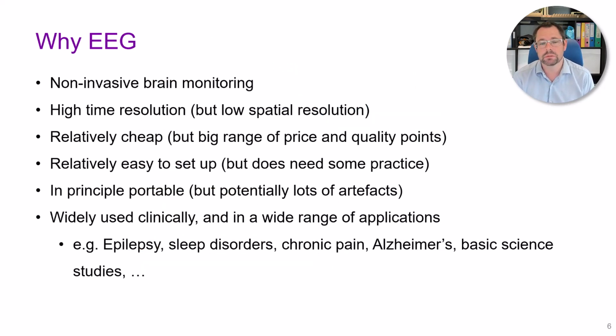And why EEG in particular? Because of course you can do optical-based brain monitoring, you can do magnetic-based brain monitoring. The nice thing about EEG is, firstly, that it's non-invasive, and also that in principle it can be portable. So we can do studies while people are in their own homes, while they're going about their daily lives. It is also very widely used.